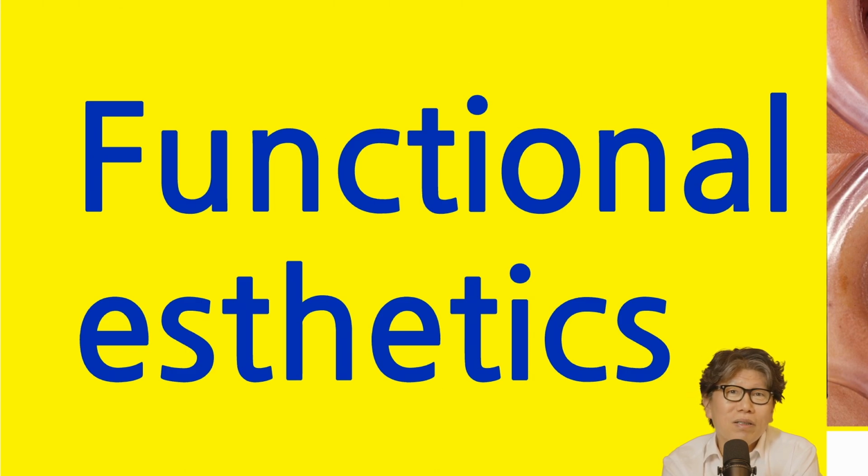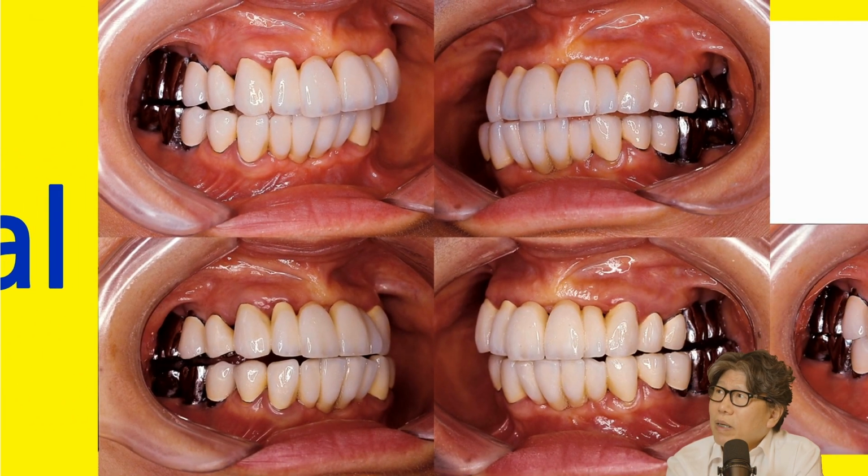But one connection has historically failed. There's no country like Korea that's unified with one connection. So the major companies have 3 different abutment connections. They even have 4. We probably have 5 different abutment connections. So we've been trying very hard to reduce the number of abutment connections because we're running out of product stock, and so do the doctors. But from an aesthetic and functional standpoint, I feel like I shouldn't be reducing the number of abutment connections.